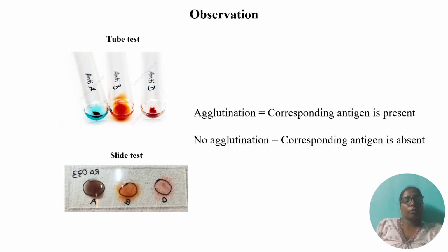Agglutination is a process of clumping of particles like red blood cells or bacteria suspended in a liquid. In biology, it is an antigen-antibody reaction where specific antibodies bind to multiple antigens forming visible cross-linked clumps. This is nothing but agglutination. It is widely used in clinical medicine for blood typing and rapid infectious disease testing also. And here we are able to observe the agglutination reaction.